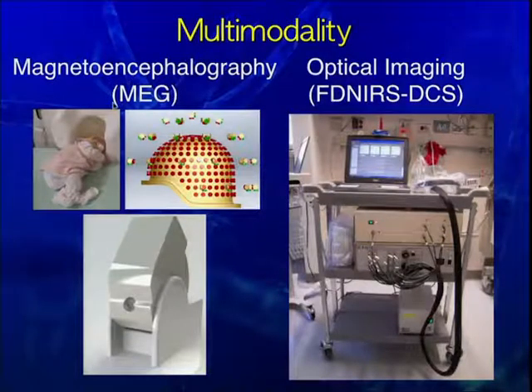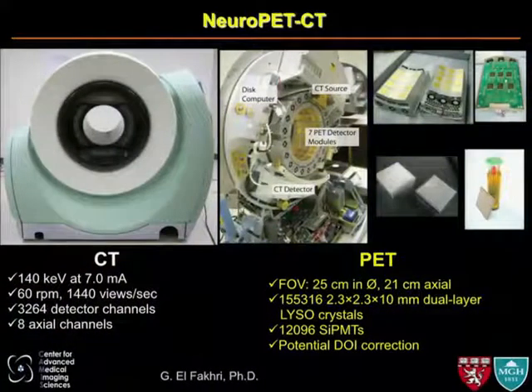We also need to have neural activity information, because whether the neurons are seizing, where the seizures are coming from, and how the connectivity is changing over time is going to be partially governed by neural activity as well. EEG doesn't work well in preterms or in terms because of the changing soft tissue swelling and changing suture size. MEG does not have those issues. So we're developing a baby MEG system that will be sited later this year and hopefully will be picked up by commercial ventures as well, to allow us to better understand neural activity.